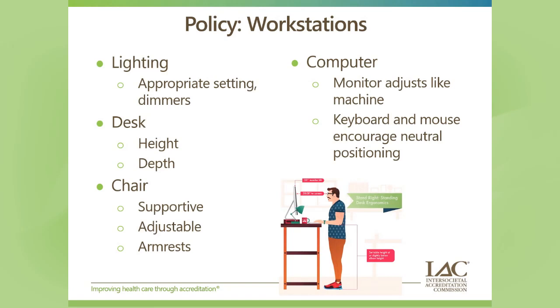And I think this is something that we indirectly think about but don't think about as much. Especially, this is your time that you're not touching the patient, and it's just as important to think about how your body's set up versus when you're actually patient facing. Of course, lighting, thinking about that in general for your room while you're scanning, and then afterwards, whether you're working on a workstation in the room that you did your exam in, or if you have to go to a separate place, ensuring that you have appropriate settings for that.